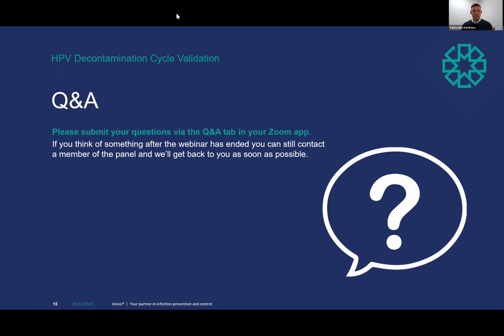So we understand hydrogen peroxide really well, and we know what we're trying to achieve with it. And we know we can get hydrogen peroxide condensing in certain levels. Technically speaking, the surfaces do get wet with hydrogen peroxide, but we control that condensation to make sure that at the end of the process, surfaces are completely dry.